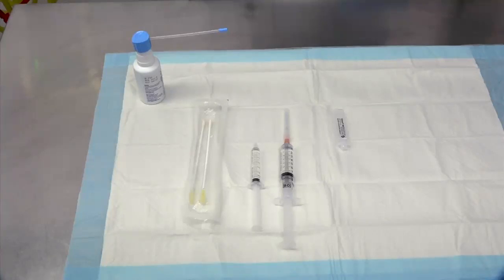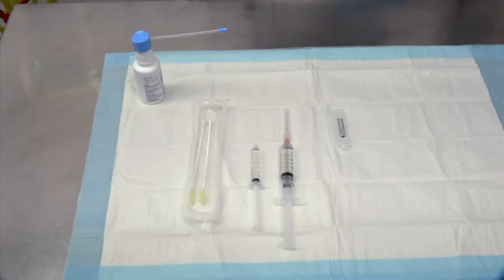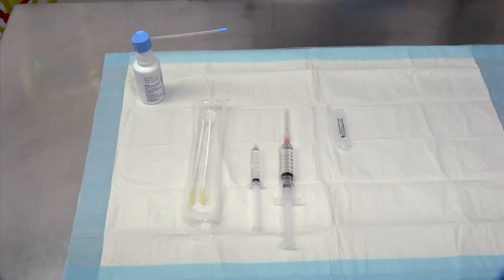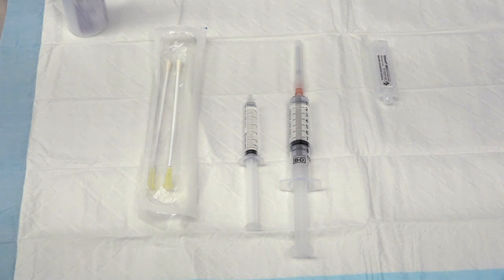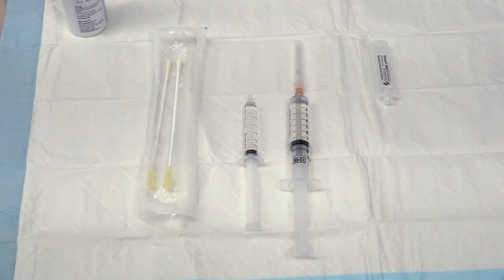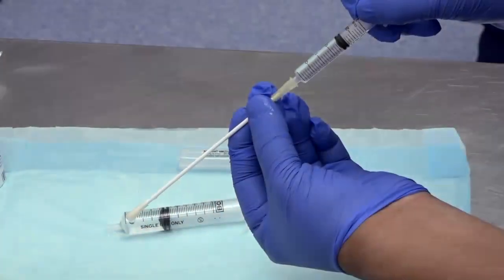The equipment required includes two hollow tipped cotton swabs, local anaesthetic to topicalize the nose and local anaesthetic to perform the block. Saturate the hollow tipped cotton swabs with local anaesthetic and ensure that you can inject local anaesthetic down the swabs.